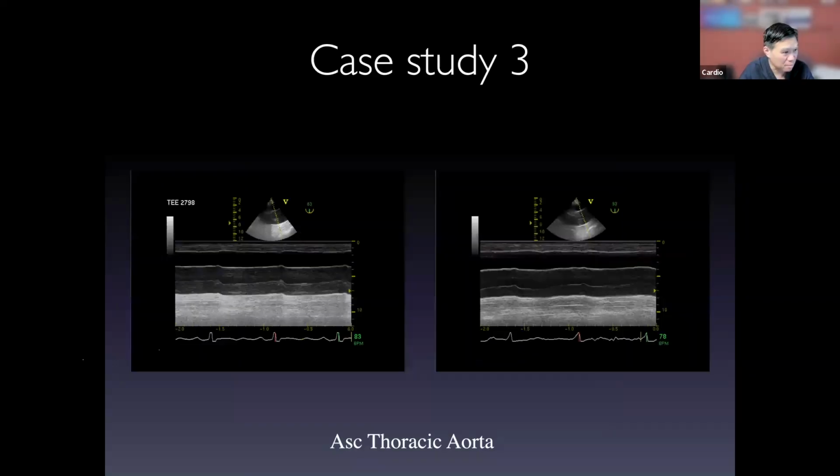Okay, so let me show you the M mode as you have discussed. Now you can see this is the proximal ascending aortic wall, and when there's a bump, there's a bump. Remember, one of the definitions of a flap is that it should move independently of the underlying structure. A dissection flap should move quite freely, irrespective of the proximal or distal ascending wall. So this is a very useful tool to see whether it moves along.